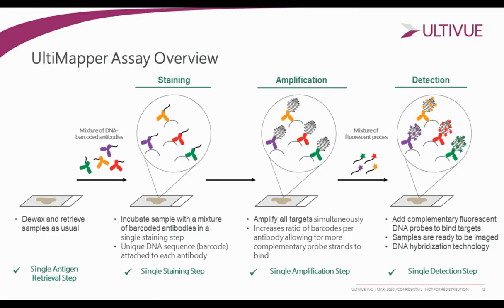The assay itself also allows us to do a single cocktail antibody staining step, and also only utilizes a single antigen retrieval step. There are no rounds of stripping antibodies off and restaining. This is a single primary antibody staining step that immediately follows a single antigen retrieval step.